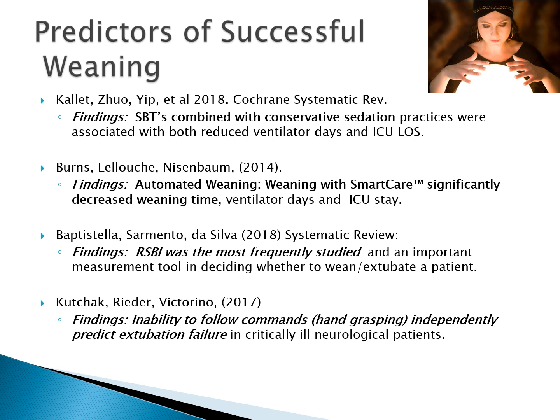There needs to be a human being involved," who has the licensure, scope of practice, and internal authority to write the order to reduce further. It can't happen through a computerized algorithm. So just something to be aware of. We do things differently than other countries, and in this country, that's what the FDA said about computerized software like SmartCare.